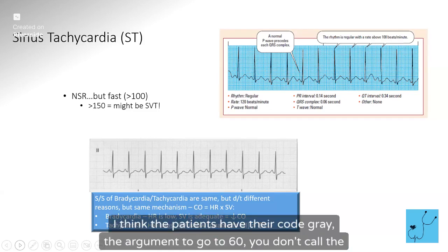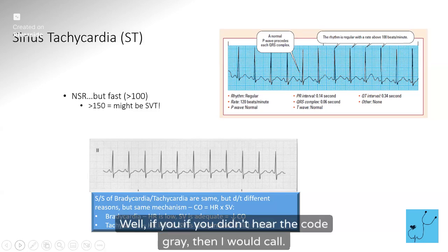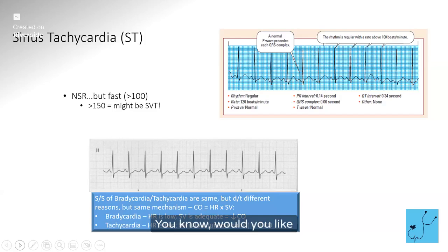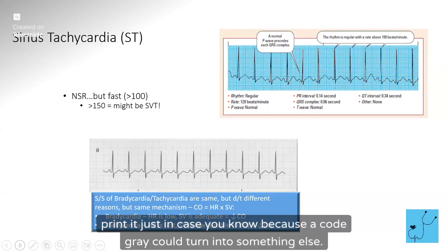So like with the patient that had the code gray and the heart rate went to 160, you don't call the nurse because they're busy. Well, if you didn't hear the code gray, then I would call. But we heard the code gray and that matched the room number we were looking at. So I'm not going to call because I know what they're doing. But would you print the strip? I don't even know that you have to do all of that. But when in doubt, it doesn't hurt to print it, just in case.